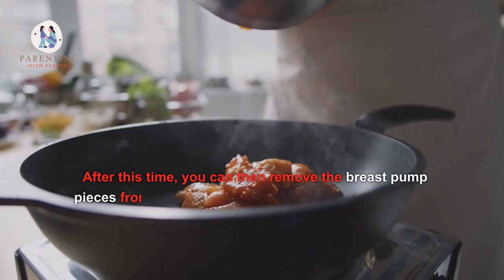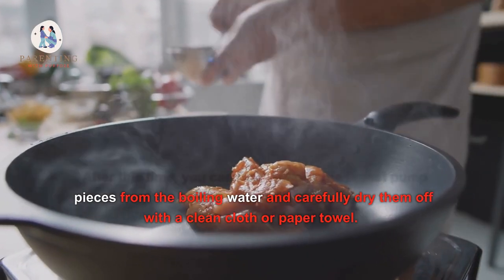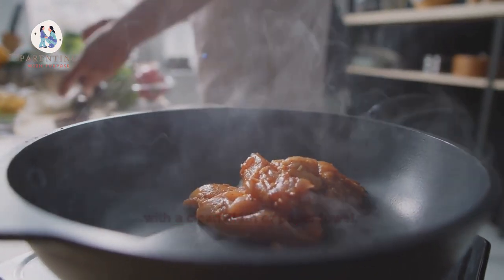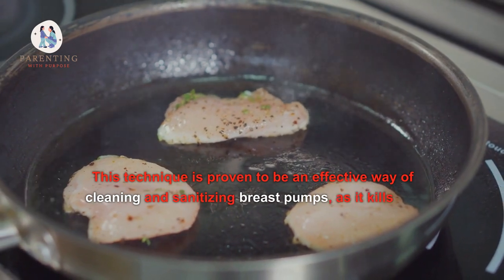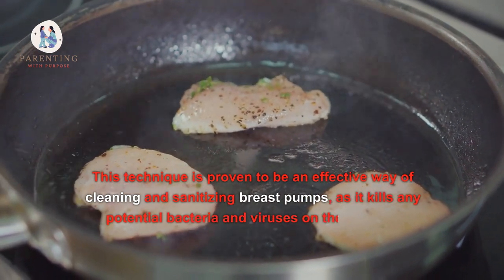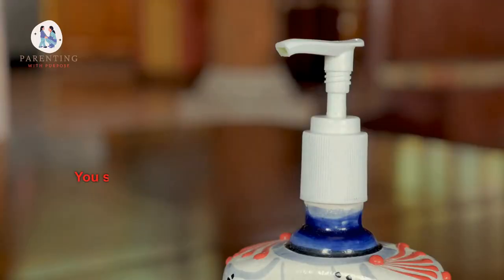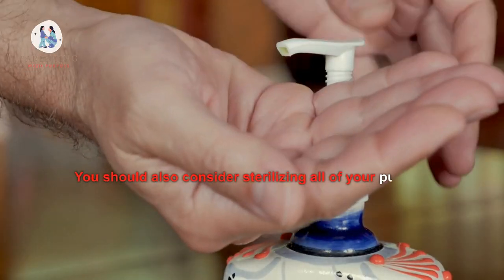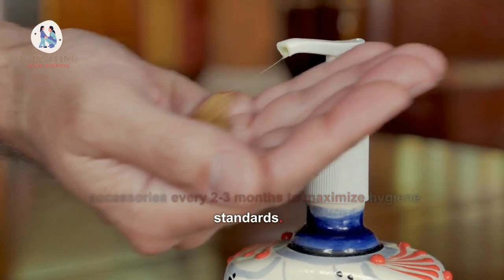After this time, you can then remove the breast pump pieces from the boiling water and carefully dry them off with a clean cloth or paper towel. This technique is proven to be an effective way of cleaning and sanitizing breast pumps, as it kills any potential bacteria and viruses on the surface. You should also consider sterilizing all of your pumping accessories every 2 to 3 months to maximize hygiene standards.